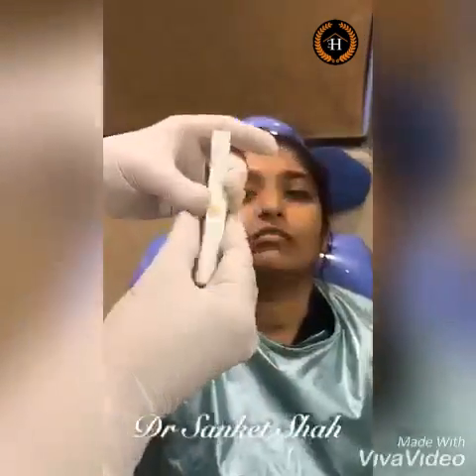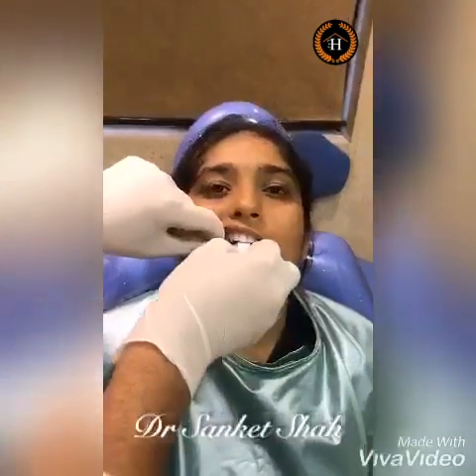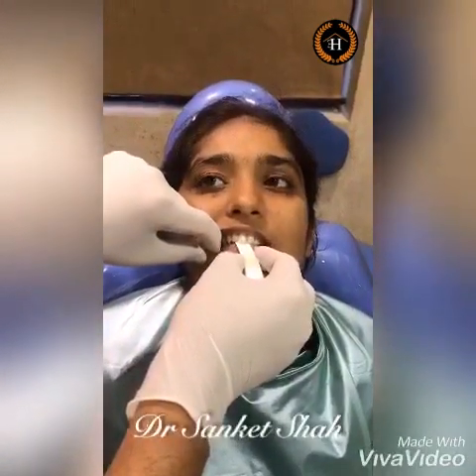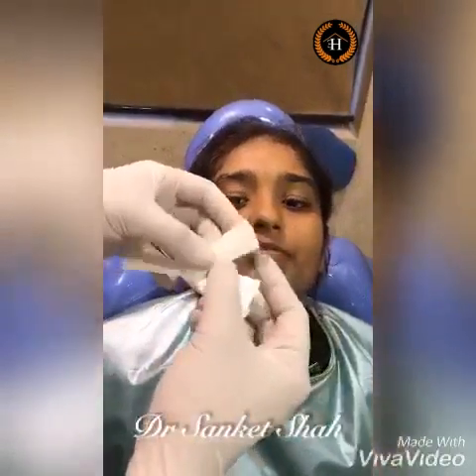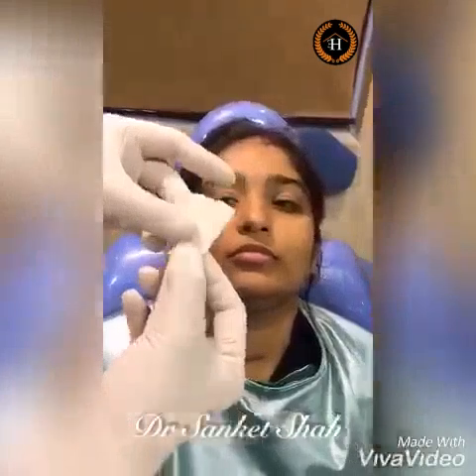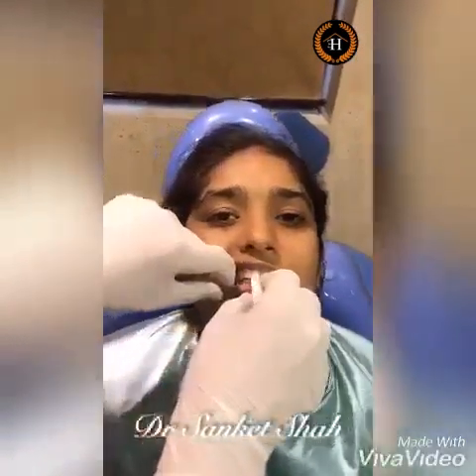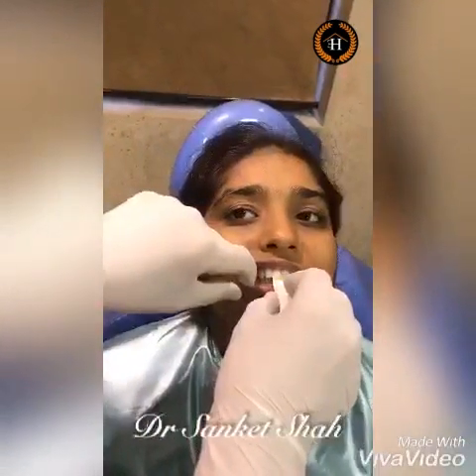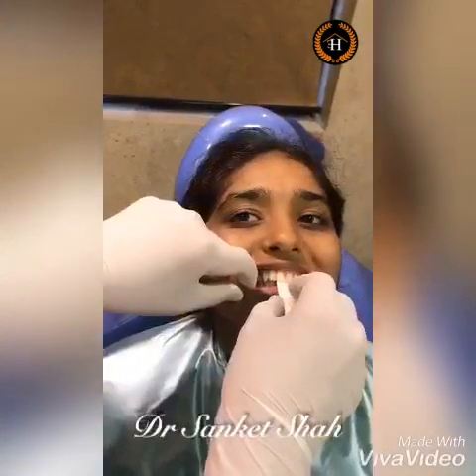First, we take the leaf gauge and insert it around the incisal edges. We ask the patient to bite from behind. All teeth are touching — forward, backward, squeeze. Open please. Now I approximately increase the number of leaves.